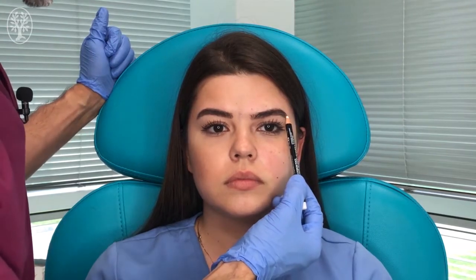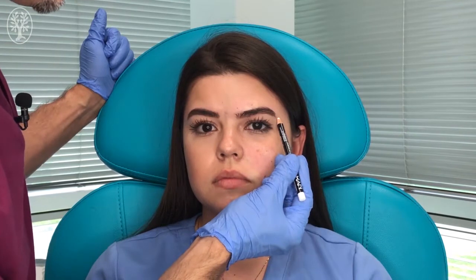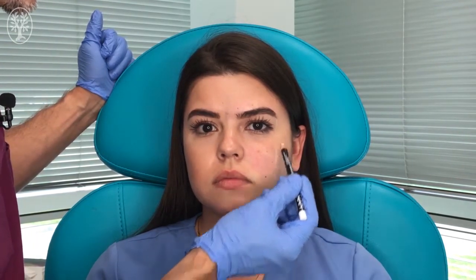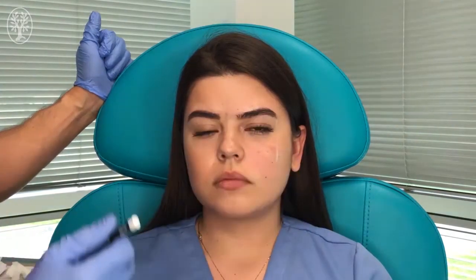We're going to do the zygomaticofacial nerve block. The zygomaticofacial nerve is located in the zygomaticofacial eminence at the level of the lateral orbital rim, a few centimeters before the infraorbital rim. If we find the lateral orbital rim here and draw a vertical line — I'm marking it for educational purposes — and then find the inferior orbital rim, the junction of these landmarks is where the nerve is going to be located.